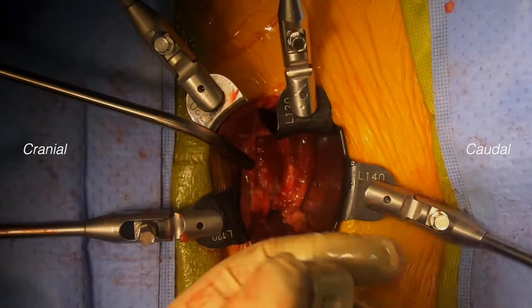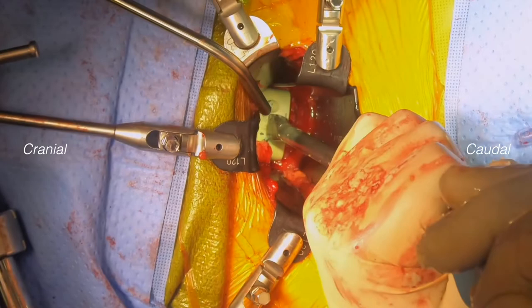With the end plates fully prepared, we pack a cage — in this case with BMP and allograft bone — and then place the cage down into the disc space, countersinking it at 1-2mm.